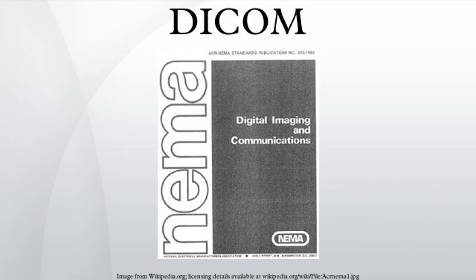DICOS, Digital Imaging and Communication in Security, was established in 2009 to be used for image sharing in airport security. Data format: DICOM differs from some, but not all, data formats in that it groups information into data sets. That means that a file of a chest X-ray image, for example, actually contains the patient ID within the file, so that the image can never be separated from this information by mistake.